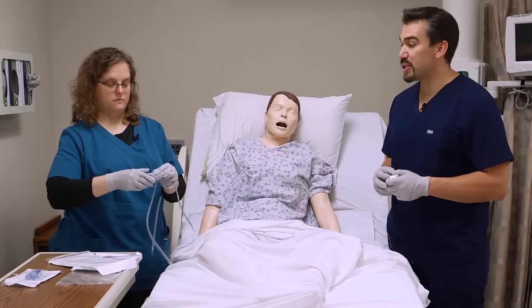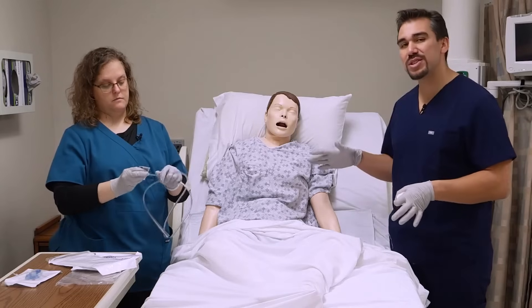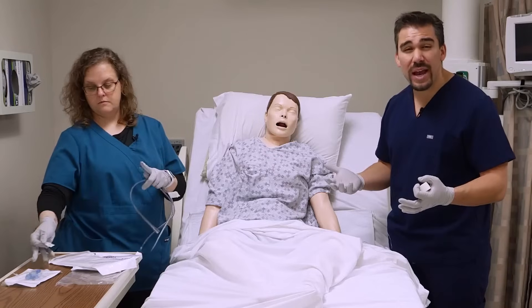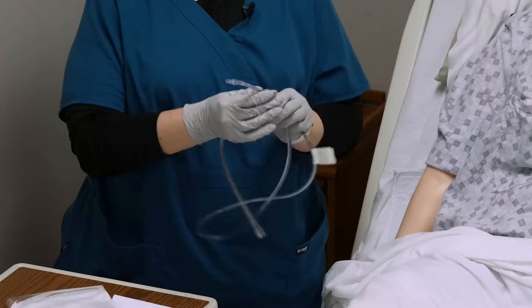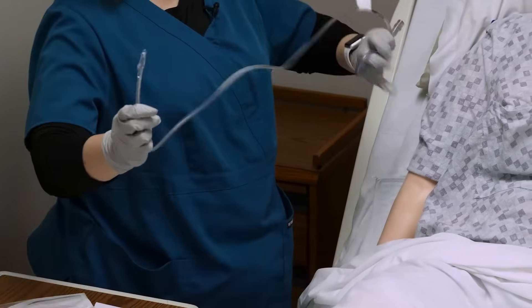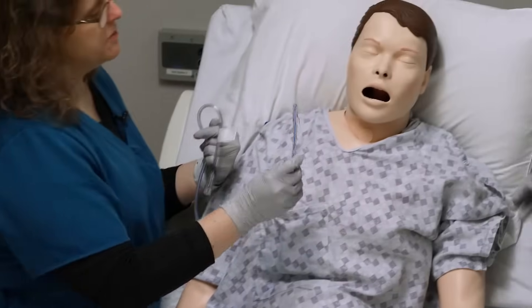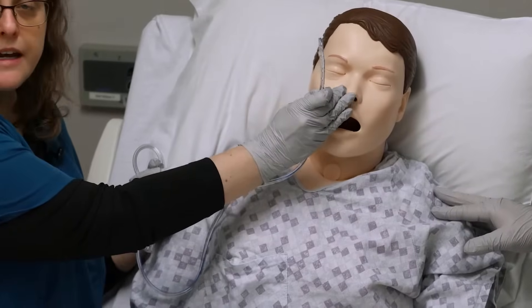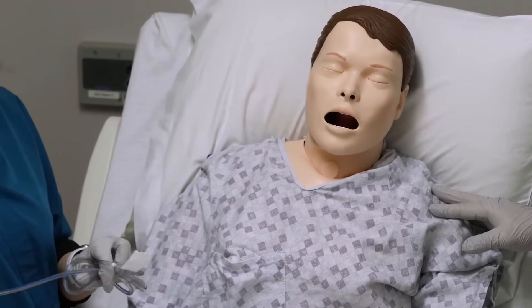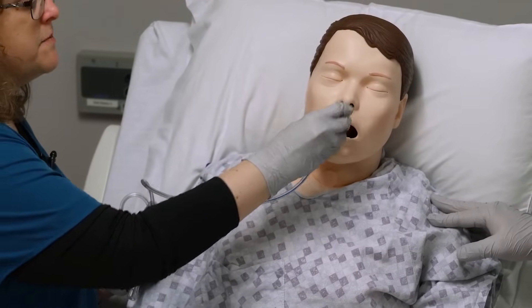The most important part here is to lube the tube, because the patient's going to be really uncomfortable as you're passing this tube past their swallow. They're going to have a huge gag reflex right near the epiglottis. Now we're going to go down just into the naris. I'm going to make sure that she hasn't had any trauma — if this person has come in with craniofacial trauma, we're not doing this at all. Now that I know that this naris is patent, I'm going to go in just a little bit.